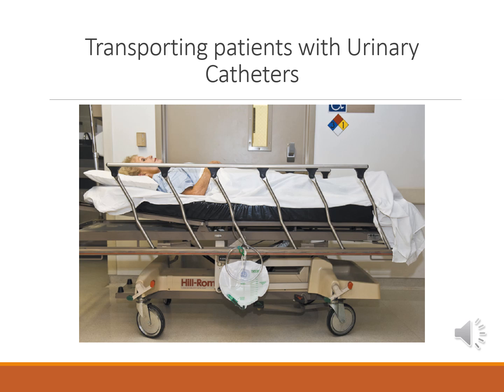The tubing should be coiled over the patient's leg and not below hip level to avoid obstruction. If the bag needs to be lifted, clamp the tubing to prevent any type of backflow.